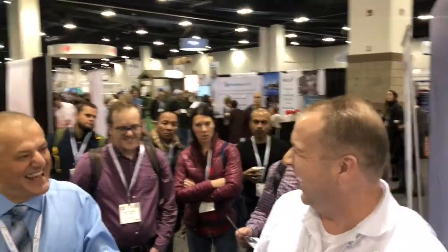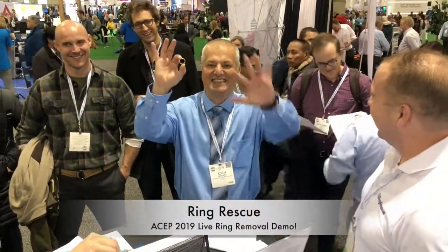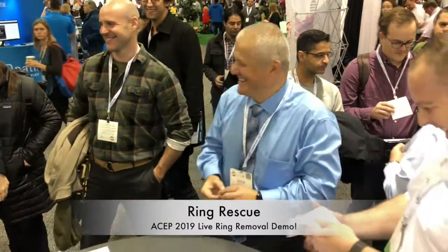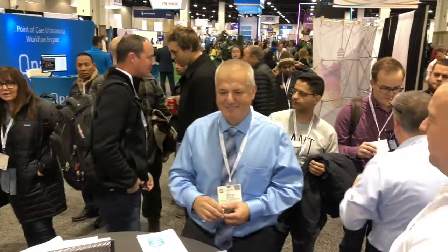This was not a set up! Back up the video to the part where he said, 'If you get that off, I'll buy one now.' Did I say that? Yeah! Let's go — that is fantastic! Look at that. I'm a free man. Outstanding, that is impressive. Seriously, that's awesome.